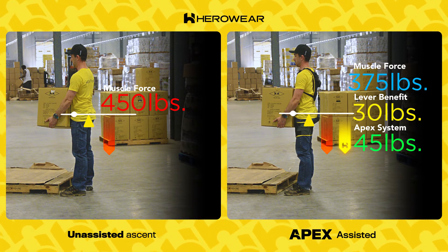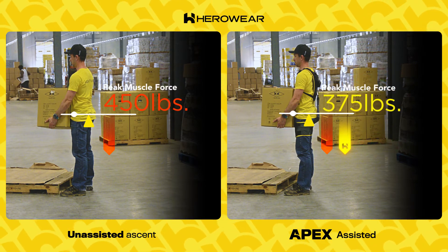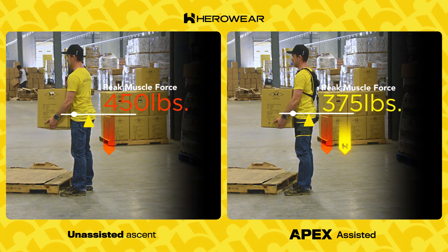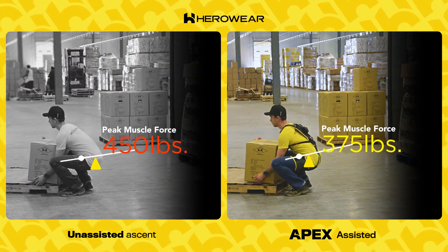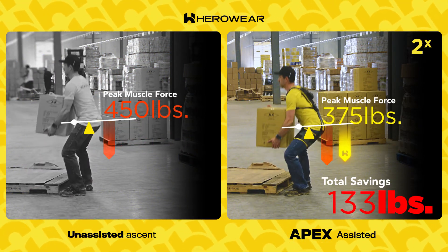This also stores energy in the bands. That means, as he comes up to a standing position, the bands recoil, helping with torque and reducing the force needed from his hip muscles and glutes to bring him upright.